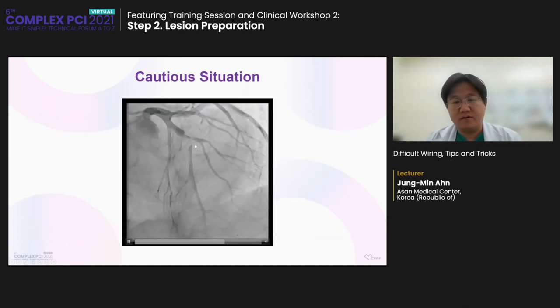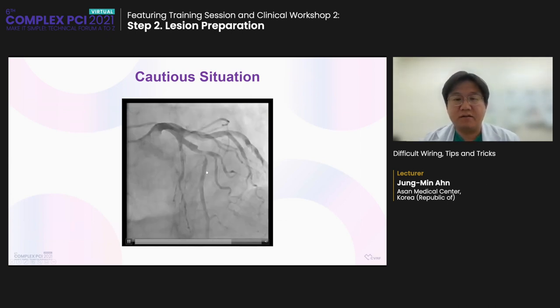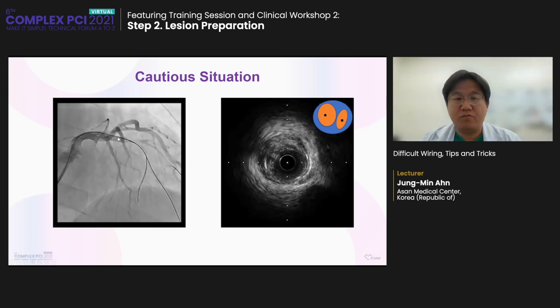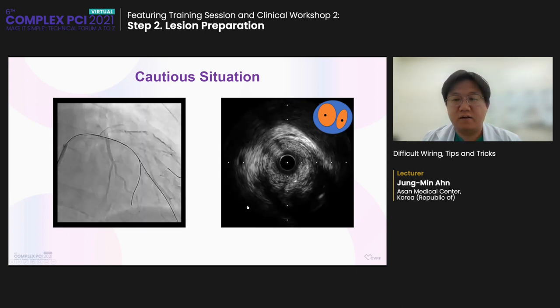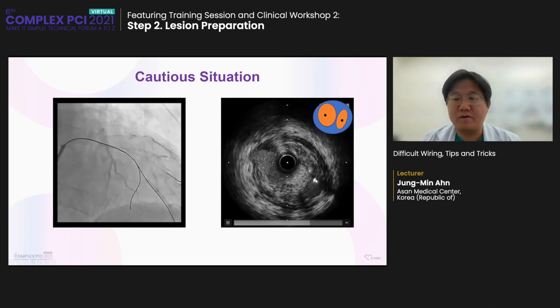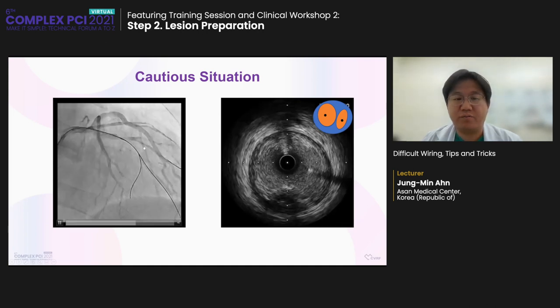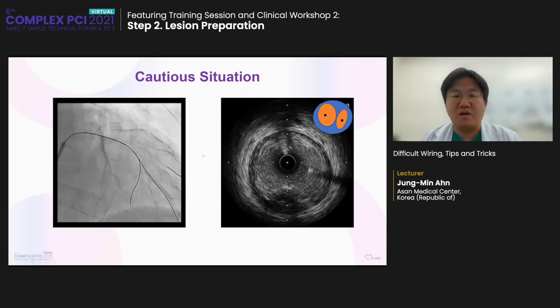Yes, subtotal lesion, sometimes we have to be cautious for the wiring because look at I wired to the diagonal branch and LAD. So sometimes diagonal branch go through the plug. In this kind of case, if you put the stent crossover, 100% side branch will jail. So for this lesion, you have to be careful.